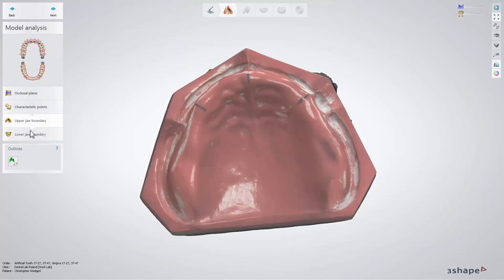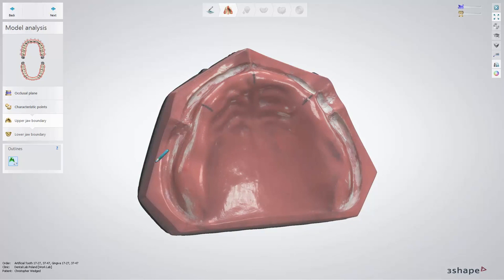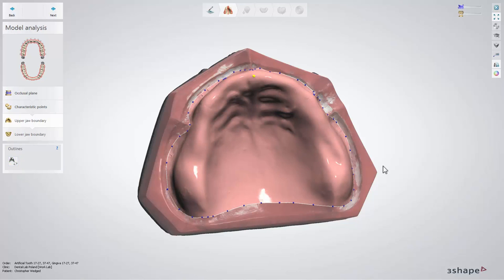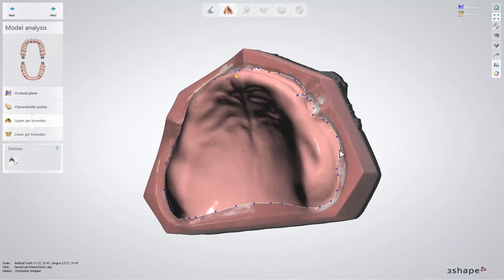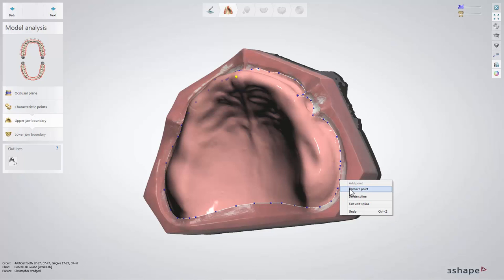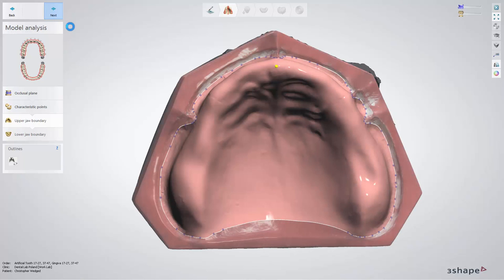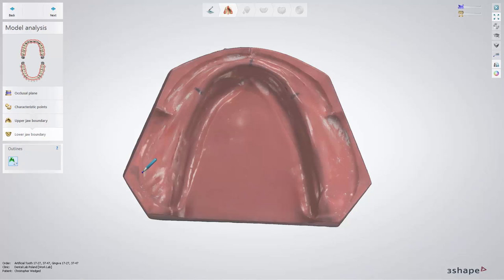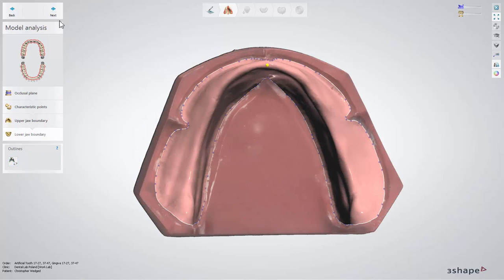This step is similar to the one while designing RPDs. Select the Draw Outline button and then use a pencil to draw the lines for the upper jaw. You can do it in two ways — either by placing points one by one, or holding the mouse button and drawing the line simultaneously. There are a few more options to modify a previously drawn outline: you can move separate points to a new position, add a new point, use the fast edit spline to reposition the outline, or remove a point or delete a whole spline. Now do a similar procedure for the lower jaw. When you have the outlines marked, click Next.